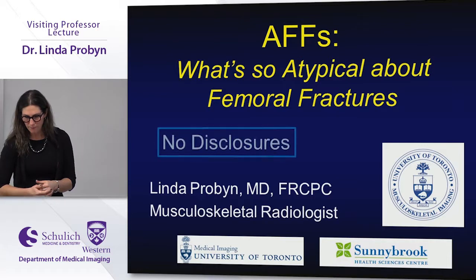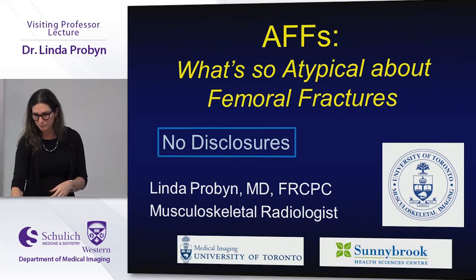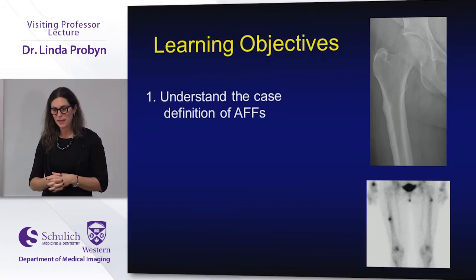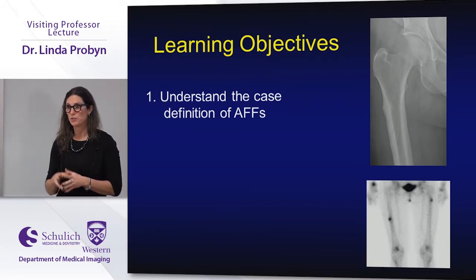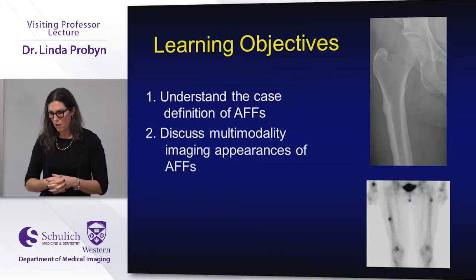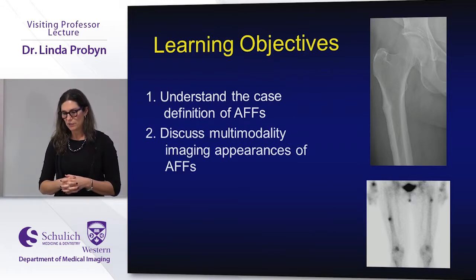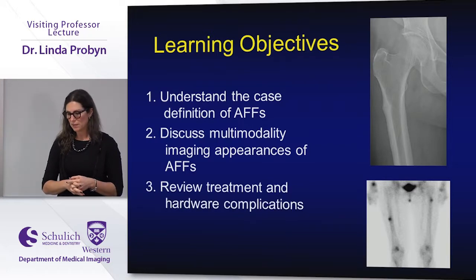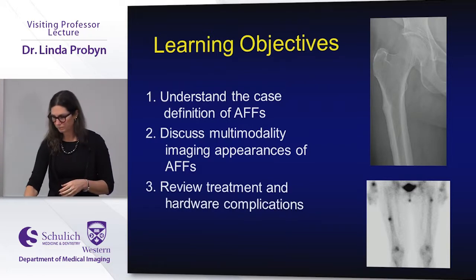Okay, so I don't have any disclosures. Today we're going to understand the case definition of atypical femoral fractures, which is key to understanding the imaging appearances. We're going to talk about the multimodality imaging appearances of atypical femoral fractures, and we're going to talk about the treatment and hardware complications.